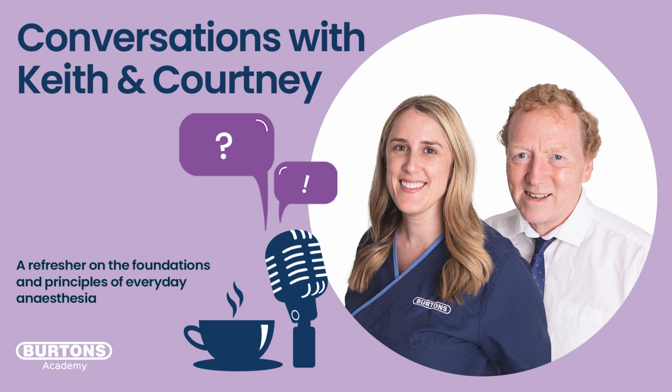Now, come back to those two concepts, which we talked about quite a lot before because they're important: tidal volume and respiratory rate. The product of those two is minute volume, and that's what matters, not the individual parts. It depends what the actual minute volume is for that patient. If the minute volume is what the patient needs, then our end tidal CO2 will be 40 millimeters of mercury. If the minute volume is less than it requires, that end tidal CO2 value is going to start to rise.